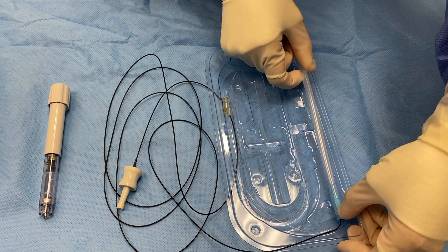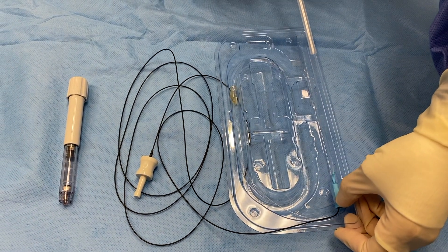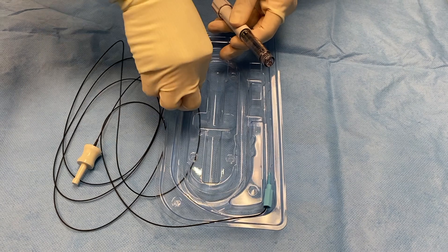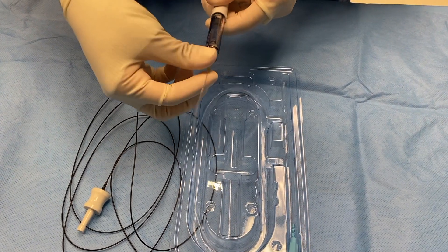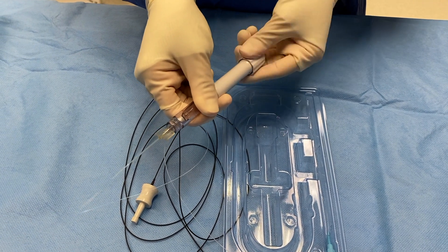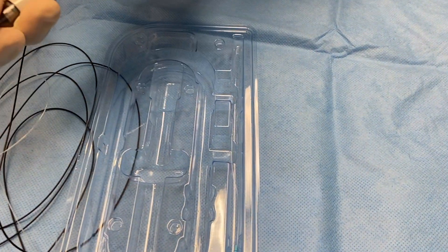Grasp the blue hub and carefully slide the protective sleeve off of the microcatheter. Connect the luer lock of the infusion line to the viscoinjector. Prime the microcatheter by turning the knob at least six full rotations until viscoelastic flows from the tip.